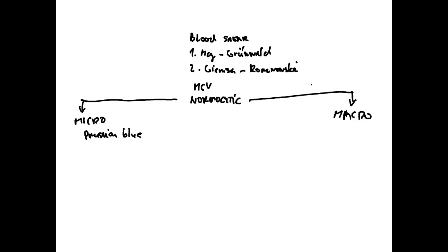If you use Prussian blue staining, you will find erythrocytes which have a nucleus, they're blasts, and around it there are storages of iron in the mitochondria, and this is of course the sideroblastic. Normally you shouldn't see sideroblasts in the blood smear. In this case you will see it. So remember, sideroblastic anemia, Prussian blue, and the most common cause is alcohol, as I said already.